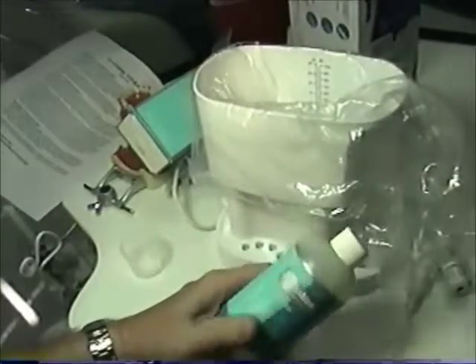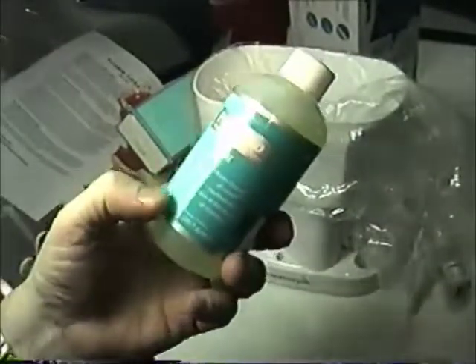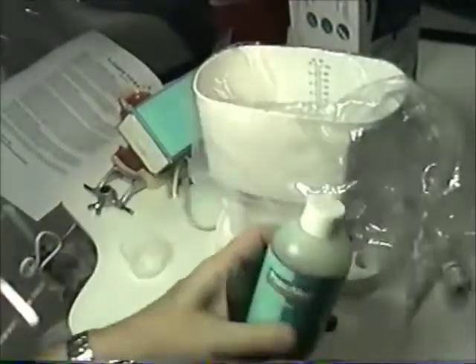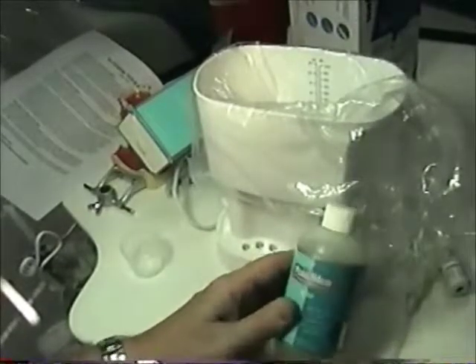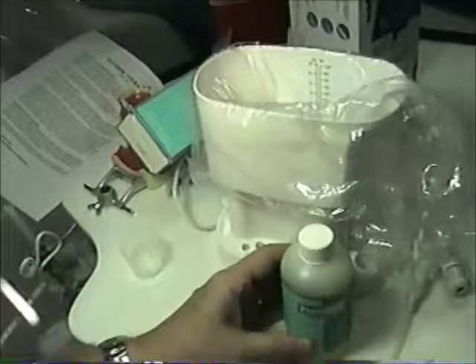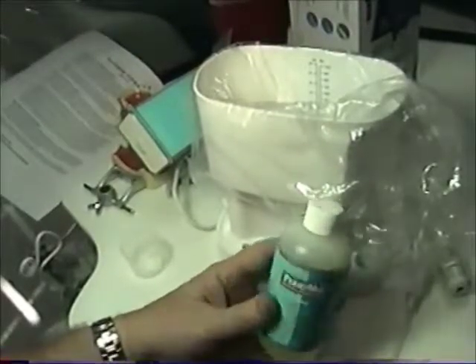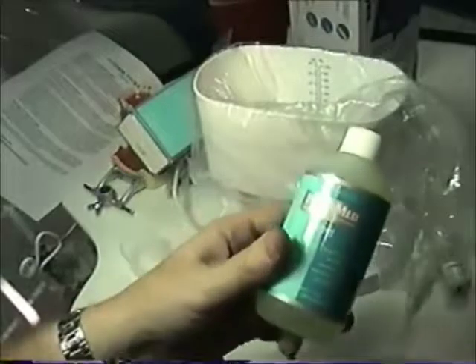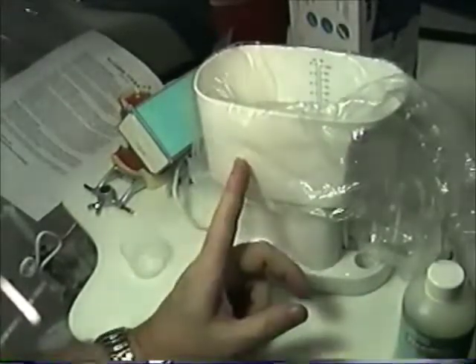Because fluoride, if it can kill these bacteria, and if you drink this thing, which is not pure fluoride but is pretty strong, you just don't want this laying around for little tiny children. And be sure you tell the children using this, if they're 9 years old, 7 years old, that they also have to take responsibility. This is medicine. So you don't want to be using more than 2 squirts in here.